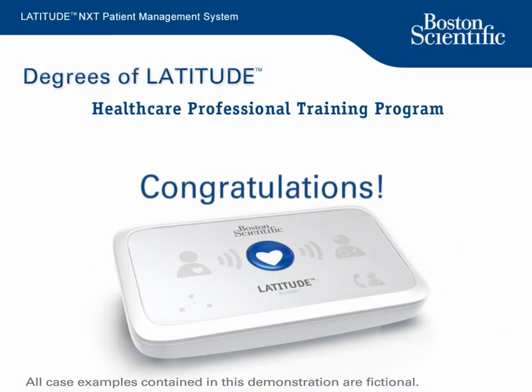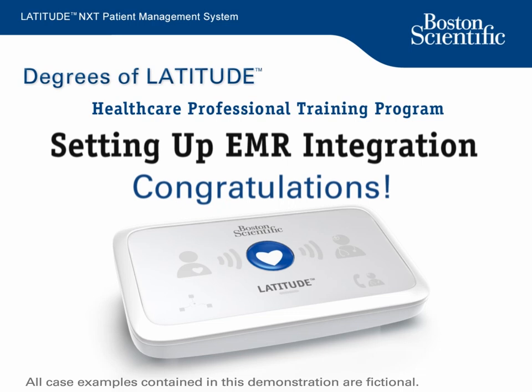Congratulations! You successfully completed the Degrees of Latitude module on setting up EMR integration in LATITUDE NXT.